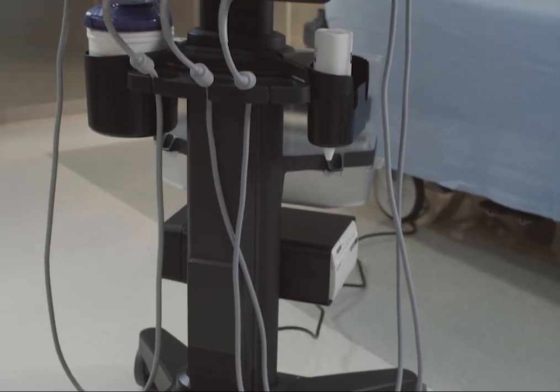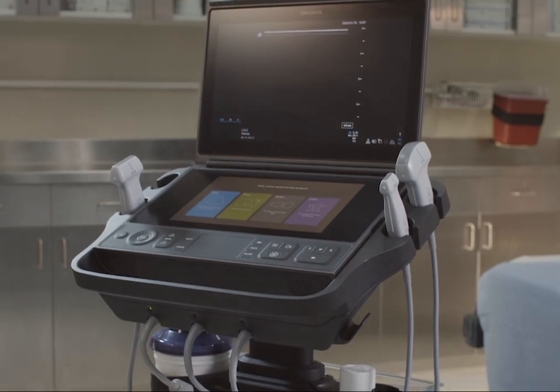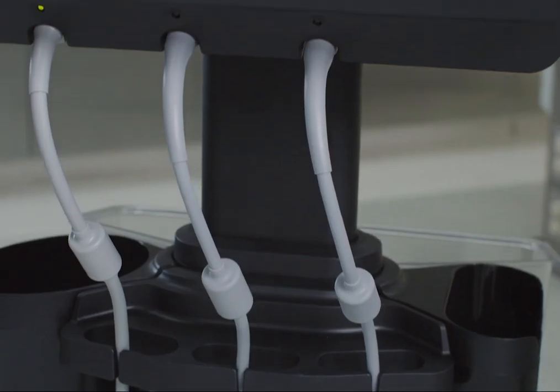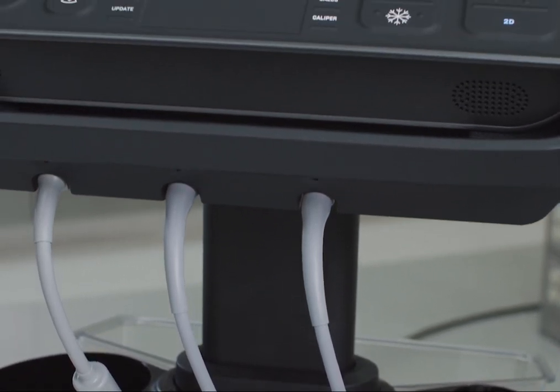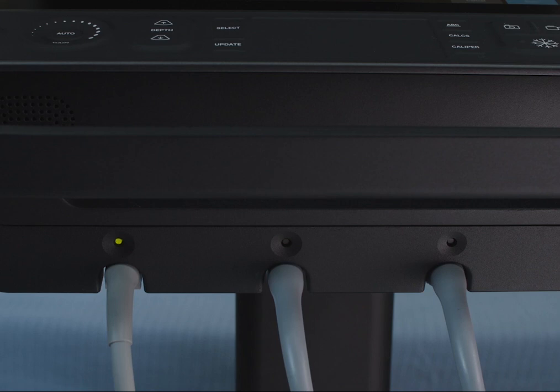The full-featured stand allows easy portability and gives you everything you need at your fingertips, including storage, gel and wipe holders, printing, and cable management. The built-in triple transducer connector, or TTC, allows you to install up to three transducers, which you can switch between at any time.